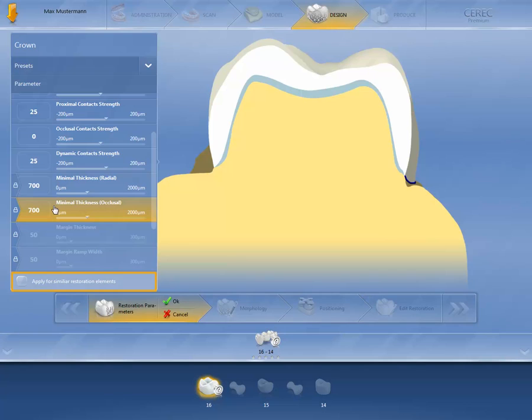You can apply the changed parameters directly to the second crown by clicking on Apply for Similar Restoration Elements. Confirm your changes by pressing OK.